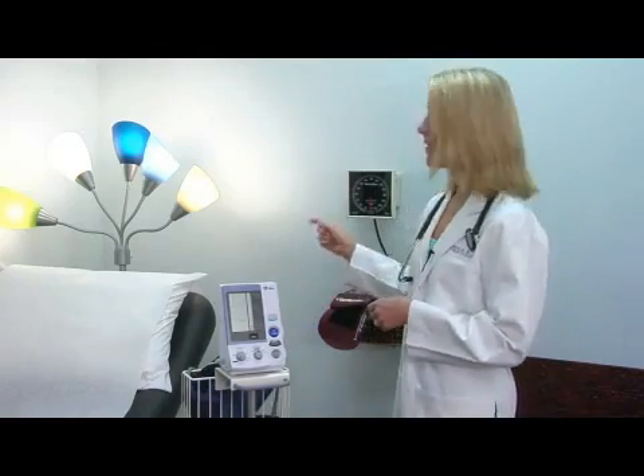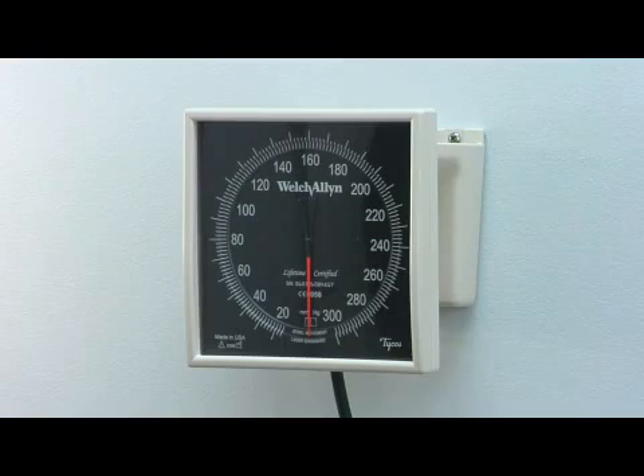In doctor's offices, we use a manual device like this aneroid wall unit right here. In this case, you need special training and generally another person to measure blood pressure. The cuff goes around the arm in the same way, but you have to listen over the artery to hear the pulsations come and go to know what the blood pressure readings are.